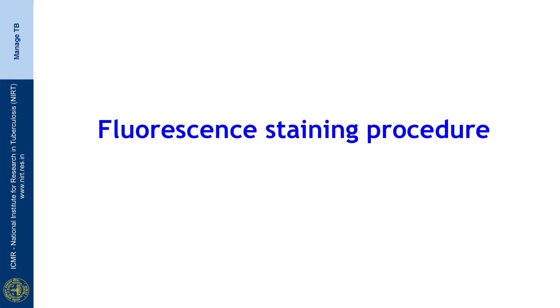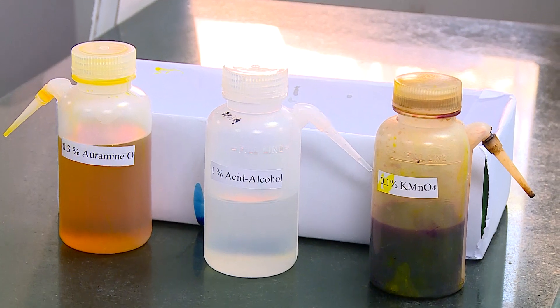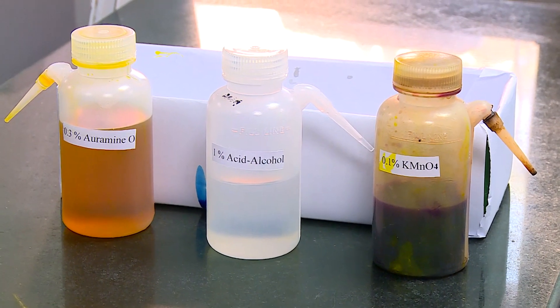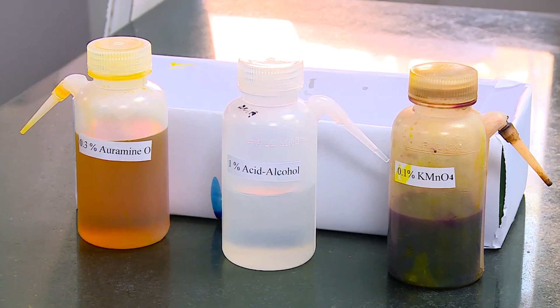Next we come to the fluorescent staining procedure. First the smear is flooded with auramine phenol and left for about 7 minutes. After washing gently with water, the smear is flooded with acid alcohol for about 1 minute for decolorization. After washing gently with water, it is flooded with potassium permanganate for about 45 seconds. After washing with water and drying completely, it is scanned under the low power dry objective and then read under the high power dry objective of the integrated LED microscope. The 3 solutions are 0.3% auramine phenol as the primary stain, 1% acid alcohol for decolorizing, and 0.1% potassium permanganate for restaining.